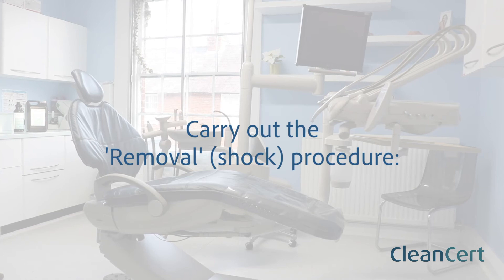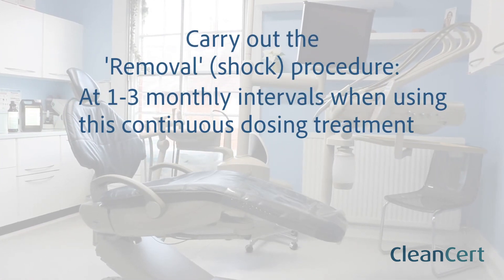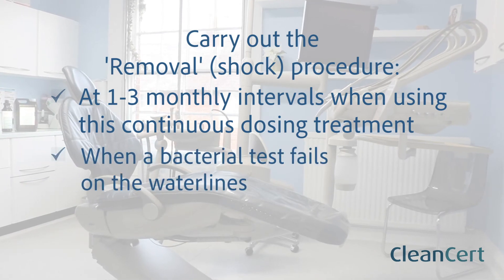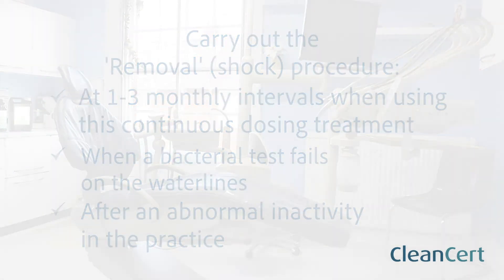Remember to carry out the removal procedure after the following: at one to three monthly intervals when using with this continuous dosing treatment, when a bacterial test fails on the water lines, or after a period of inactivity in the water line such as lockdown.